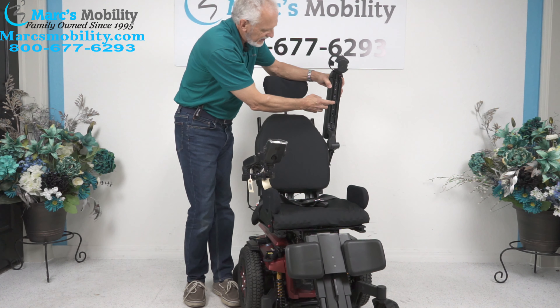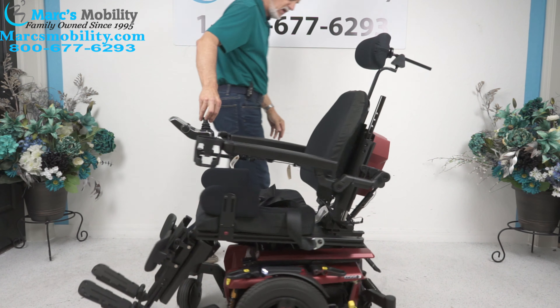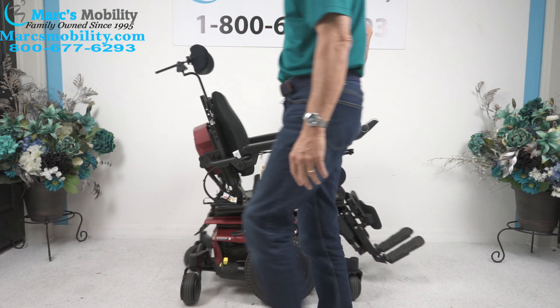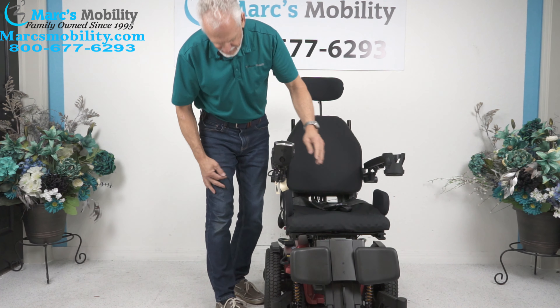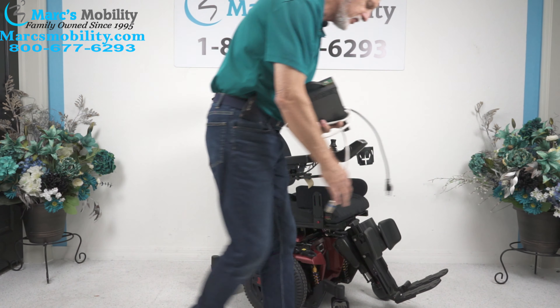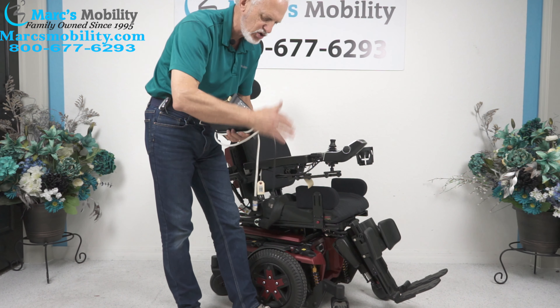Also with this chair, there's a little mini button right here. If I hit that, you can see the headlights and the taillights come on. Your taillights are over here and your headlights are here — so you have lights on this chair. The button for the light is this mini button right here. When you charge this chair, you plug your charger right below the joystick. When the light turns green, you're fully charged and the charger will stop charging.